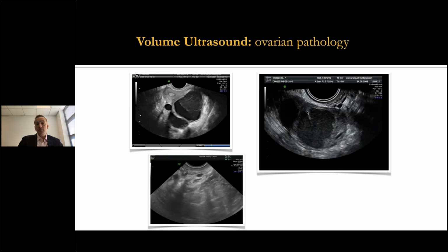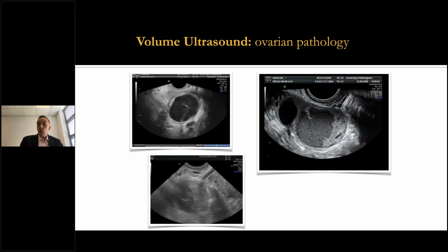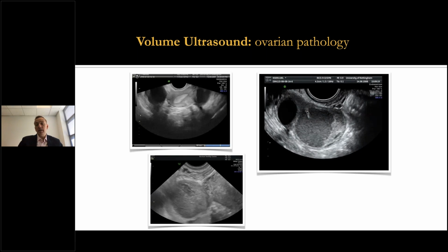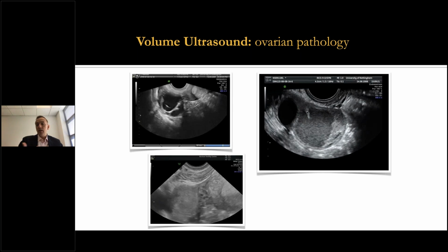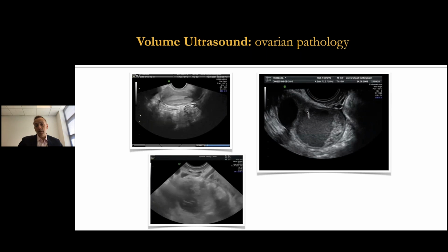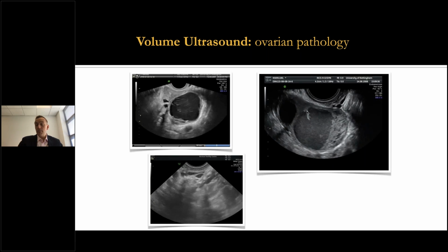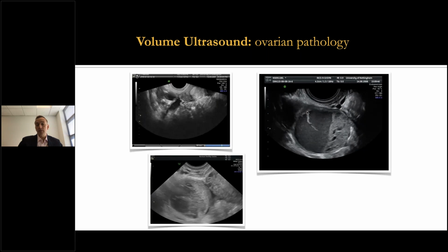And in contrast, here we have some hemorrhagic cysts. They're very different. You do have different appearances depending on the level of fibrin organization. So the classic spider web, then as the cyst has been staying along, which you can see on the right side, the clot starts to form and you get organization with breakdown into the different components of the blood, the serum and the red cells. So often considered benign. I would just recommend checking estrogen and progesterone levels in some of these patients.